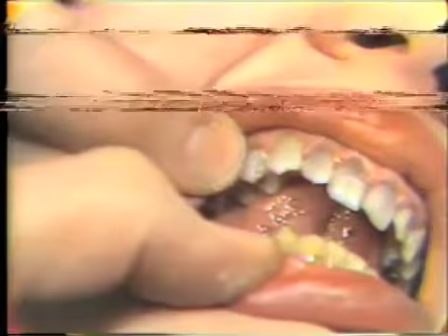Okay, we can see some change between the upper and lower teeth. And I see a little burn over here on the gingiva. You want to turn your head over this way a little bit, Carolyn? See this little white spot right on the papilla. Okay, now let's finish our procedure by taking some pictures again.